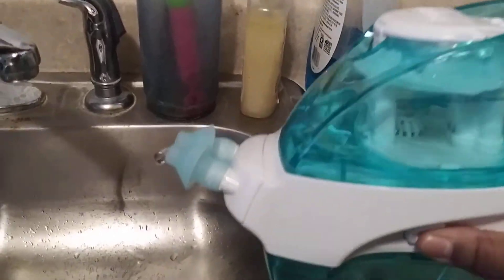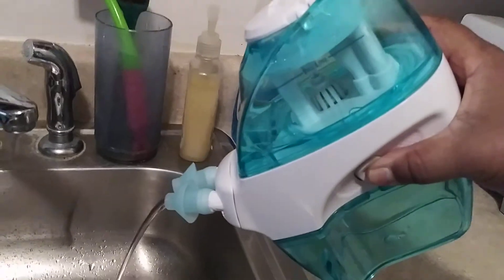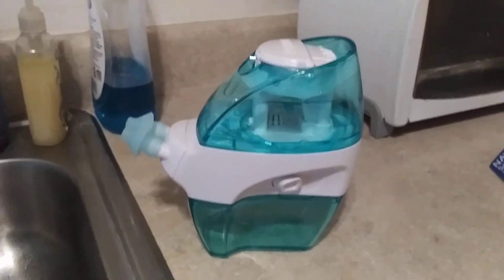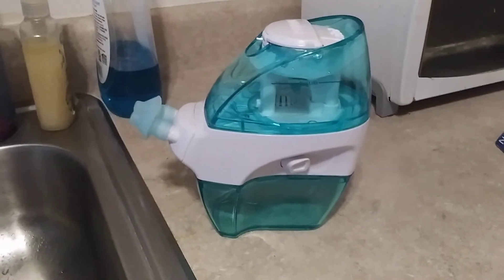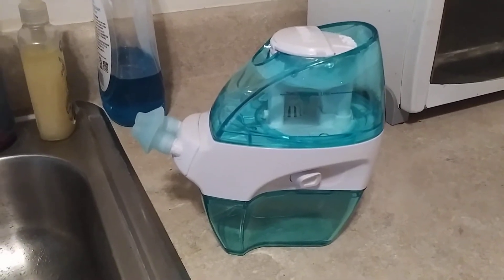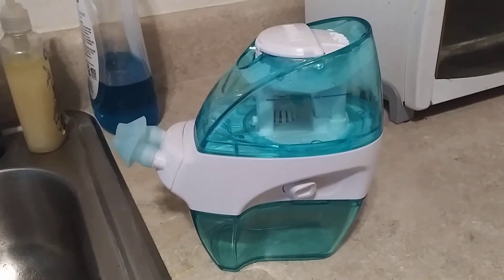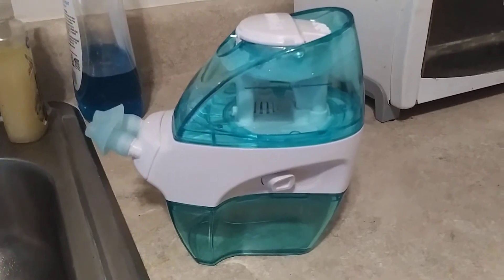At first I thought maybe the batteries ran down, so I put some new batteries in — it was still doing the same thing. Last night when I tried to use it, it didn't make any sound at all. Luckily I didn't have to pay for it, but I did buy a case. The gentleman told me to just keep trying; if not, I might just have to get another one, which I don't want.